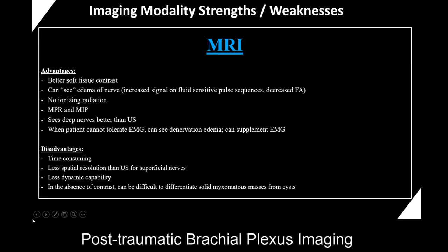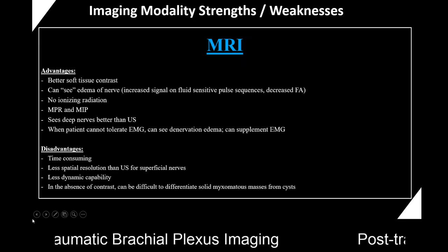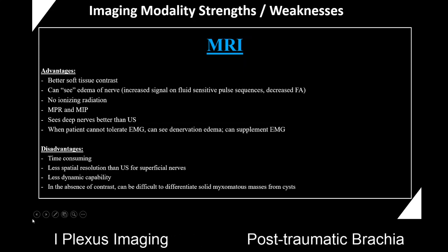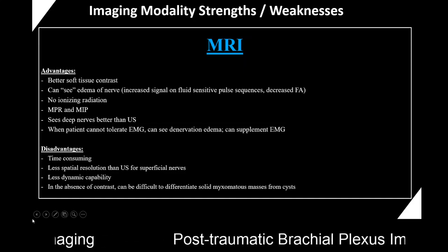Disadvantages: this is a time-consuming procedure. The patient has to be inside of a scanner, sometimes between 30 and 60 minutes, maybe even more if you're adding on additional sequences, and especially for a claustrophobic patient, this is a difficult task to do.